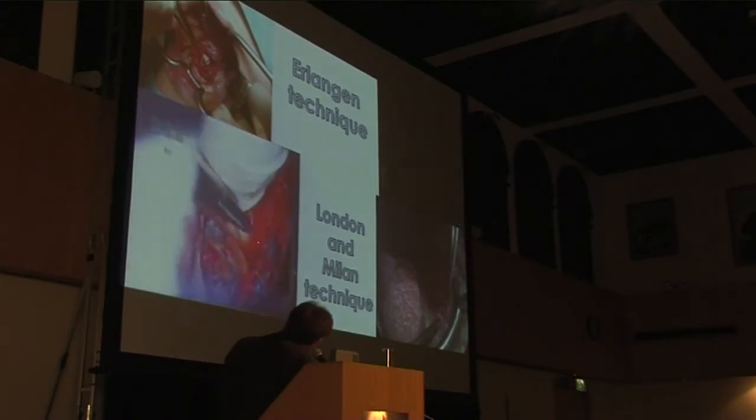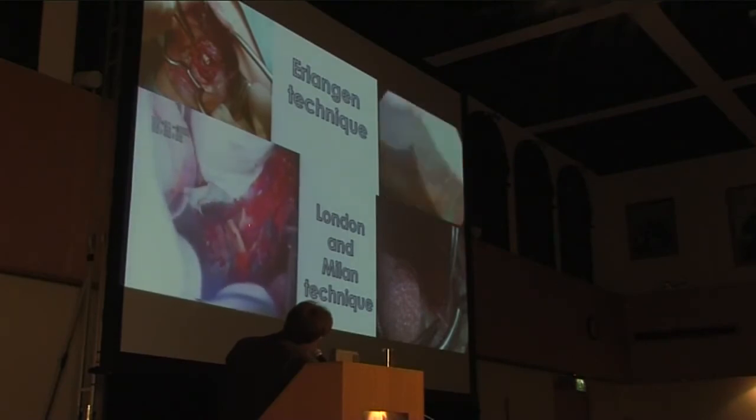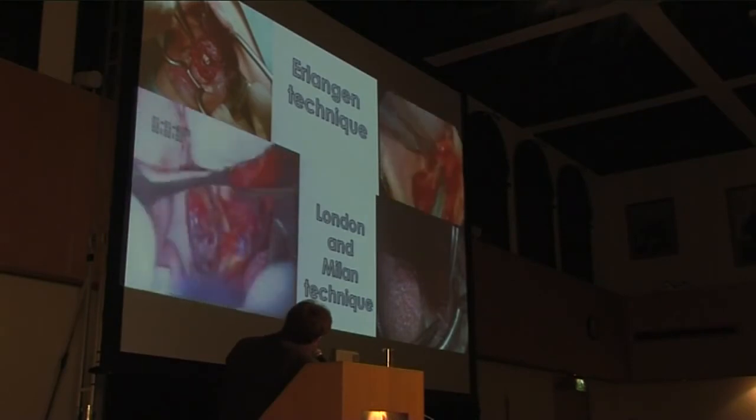We are at the end of the prolonged duct dissection technique described by the Erlangen group. Here we are in the parenchyma of the gland, where we are making the simple and minimal incision of the parenchyma. Then you can enter with the elevator in order to detach the stone that is blocked into the parenchyma in order to favor removal of the stone. This is to be considered a minimally invasive technique as you preserve everything — we have functional preservation of the entire gland and the ductal system.